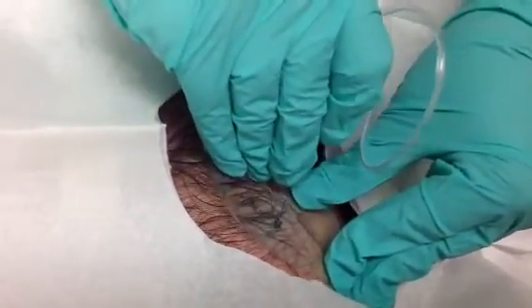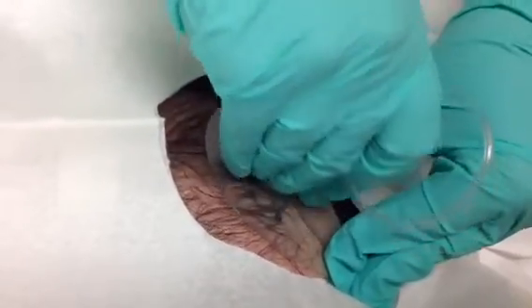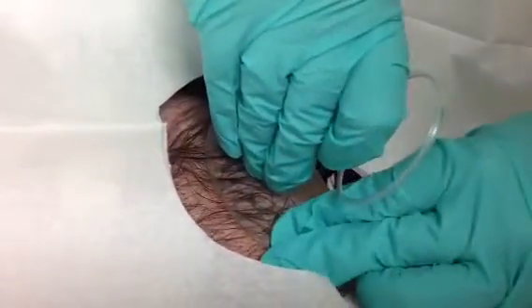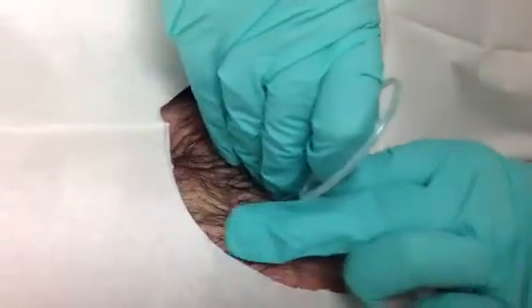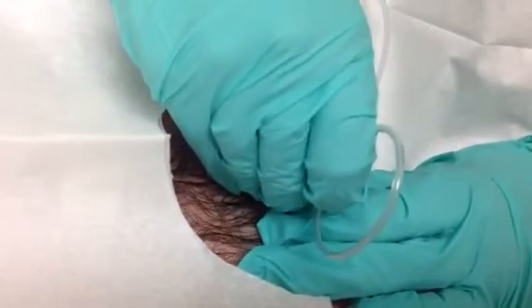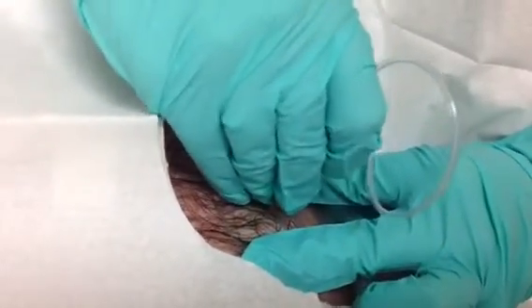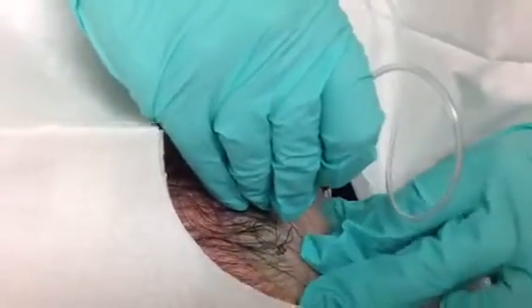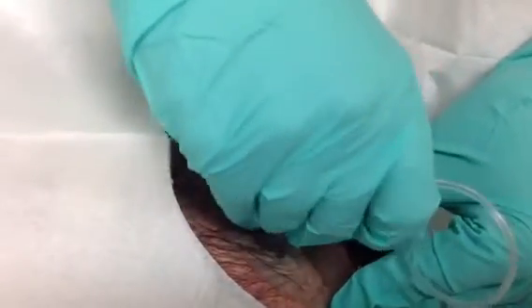Are you doing okay? No. How do you know where you're in? You can feel it kind of — feels like you poke through an eraser almost, and then you get fluid drawback, which is the biggest sign. Yours today is hidden. It's being stubborn.